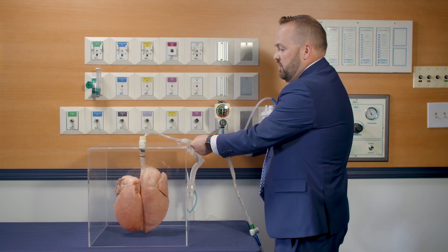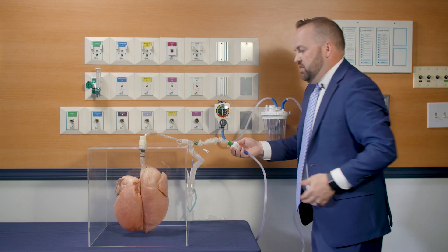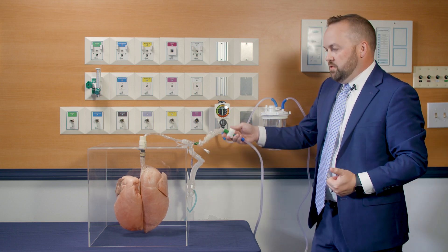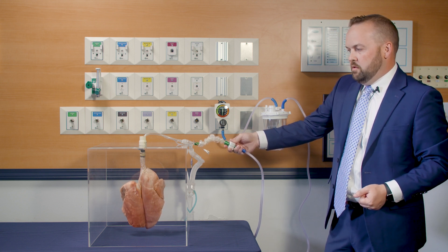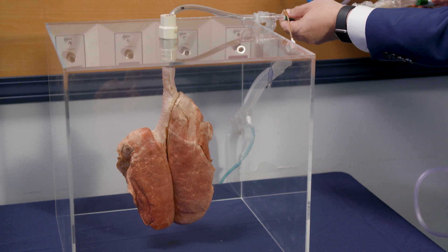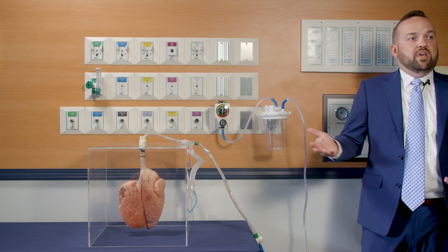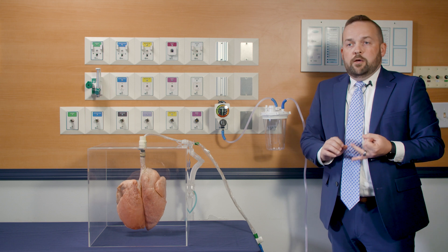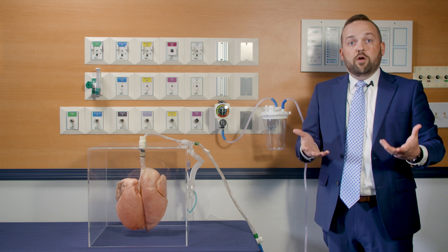I'm just going to insert the catheter here just like we normally would. On the next breath, I'm going to apply suction. What you can see is how quickly those lungs completely de-recruit — you cause a massive amount of atelectasis and it takes the ventilator a lot of time to recover from that. Our patients are going to become hypoxemic, potentially have dysrhythmias, and have a lot of problems resulting directly from over-suctioning. As you can see, using full wall vacuum can significantly de-recruit the lungs in a very short period of time, and we could be causing harm to already critically ill patients.